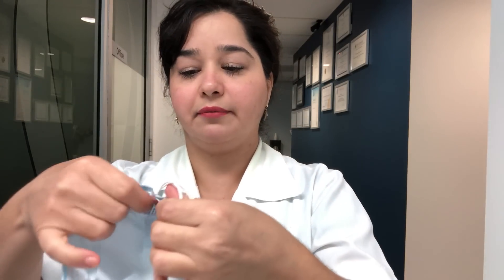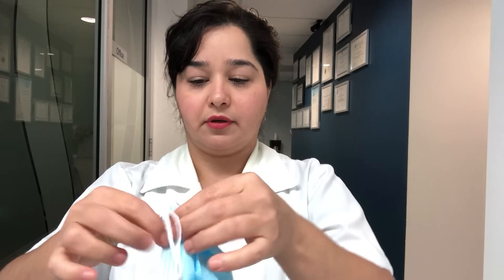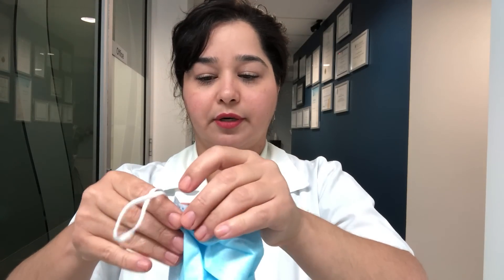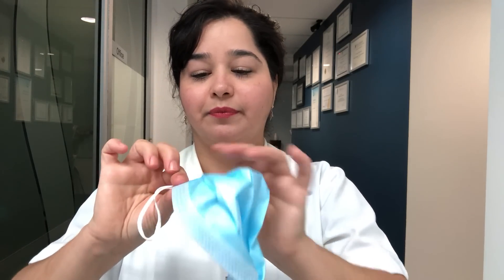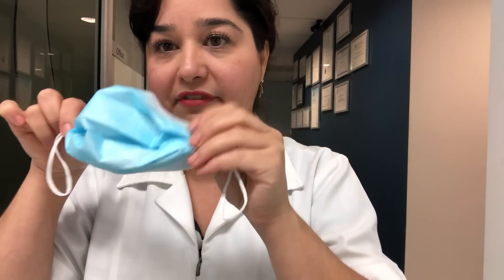Do the same thing on the other side. This actually doesn't take long after you do it a few times — I'm just doing it a bit slower because I'm showing you. That's the effect you're aiming to achieve. Put the mask over your nose, adapting it well, and make sure that you seat the mask nicely and extend it under your chin.